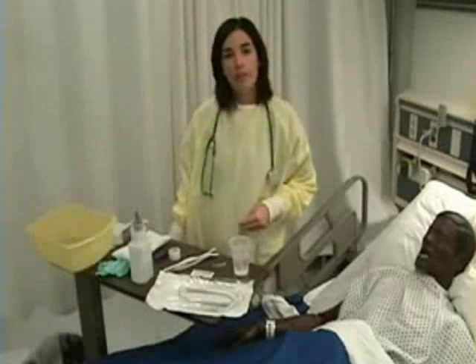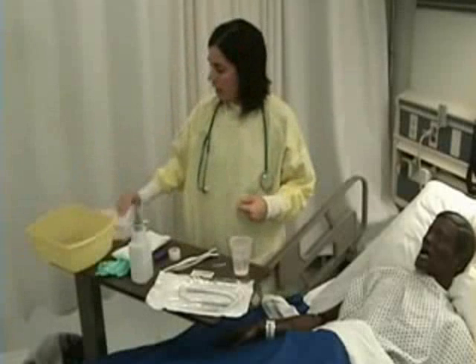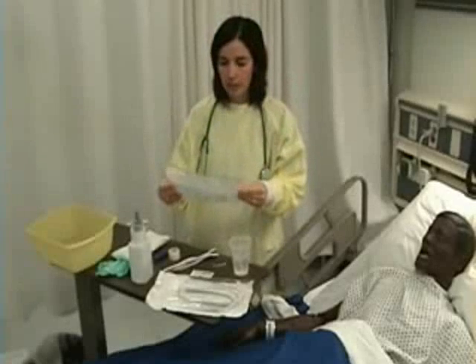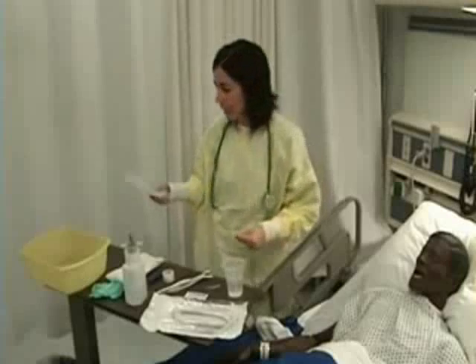You will also note that I am wearing personal protective equipment. Today I'm wearing my yellow gown. I would wear a mask with a face shield to protect my eyes since I'm going to be potentially coming into contact with gastric contents, but for demonstration purposes I will set this to the side.